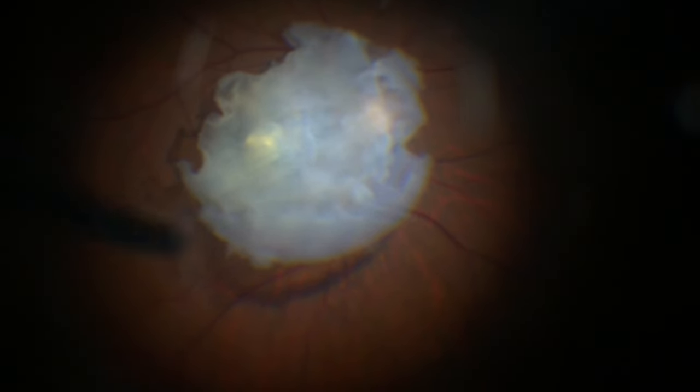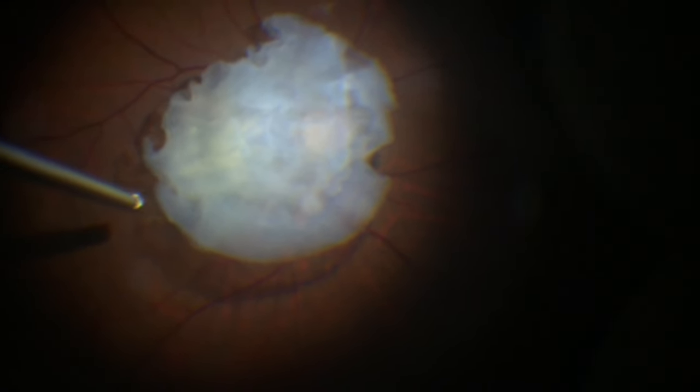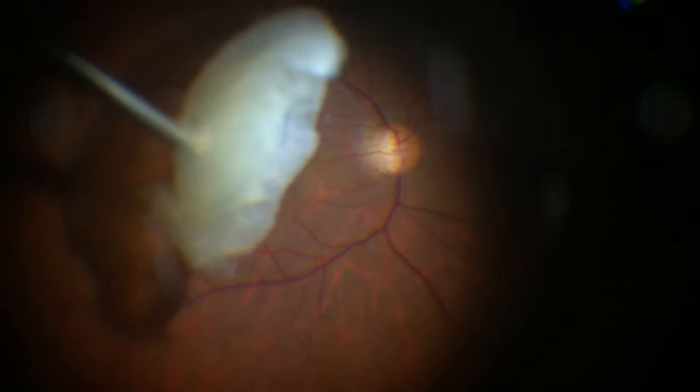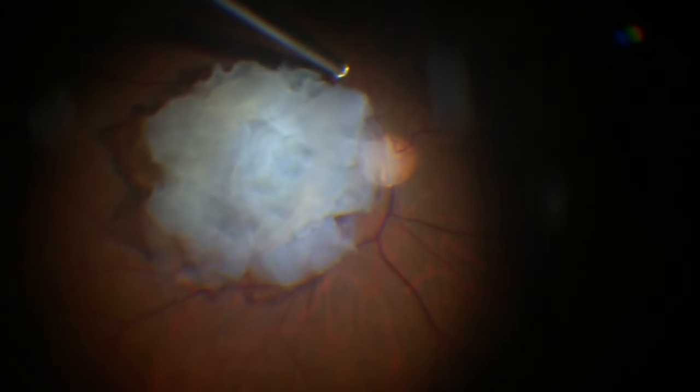As we can see, the partially consumed lens is resting on the posterior pole over the macular area. Although a PFCL bubble can be placed to protect the macula, because this lens is floating in Ringer's or BSS, it has less weight and easily floats in the cavity — it doesn't fall down or cause trauma to the macular area, so a PFCL bubble is not necessary here.